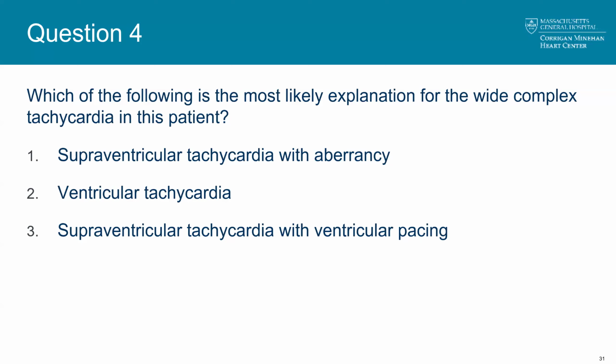Ventricular tachycardia, well, we see no fusion beats, right? And the Brugada criteria were not met, right? So those are items going against ventricular tachycardia.